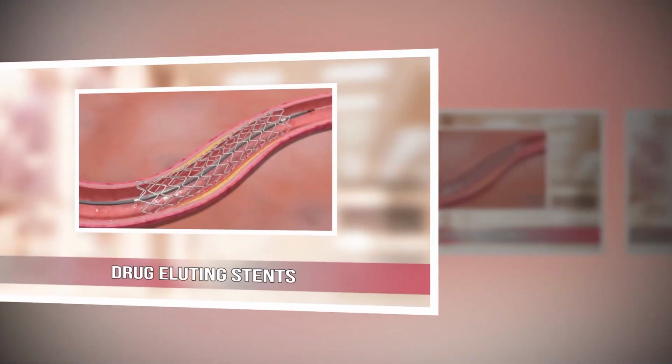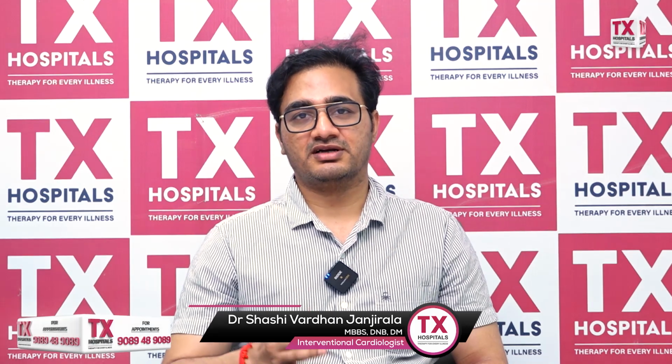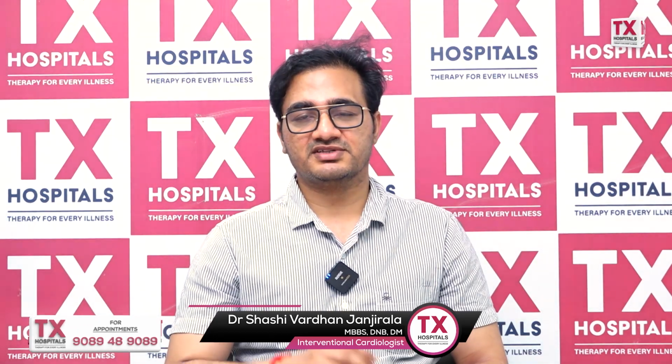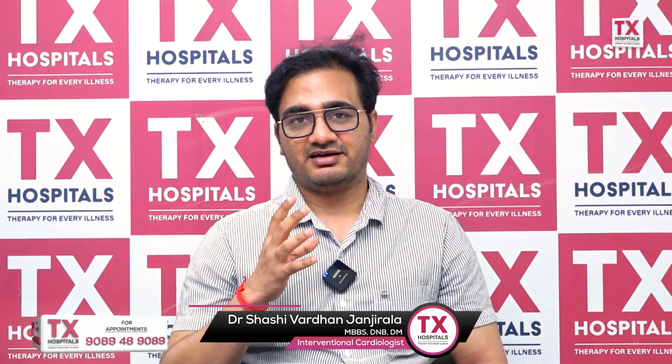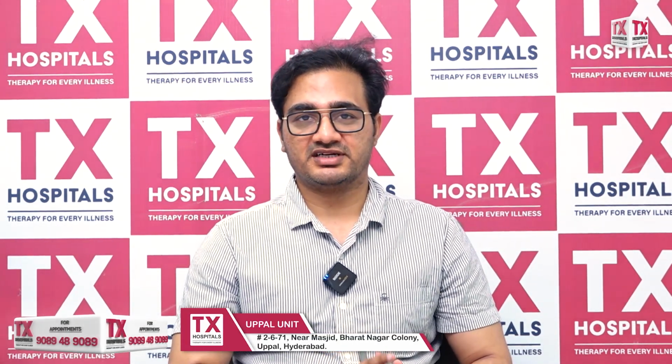Going back to the history, we used to have bare metal stents, without drugs. Recently there are many companies, and 99% of the time we are using only drug eluting stents. We have sirolimus, everolimus and zotarolimus. These are the drug eluting stents which we use in coronary artery blockage. Other than coronary artery blockage, there are other places where we put a stent.